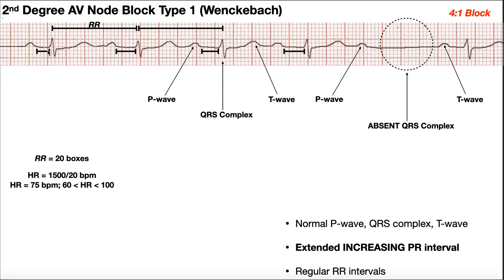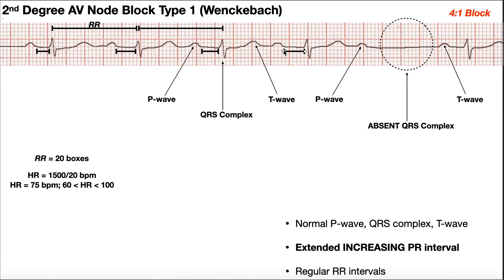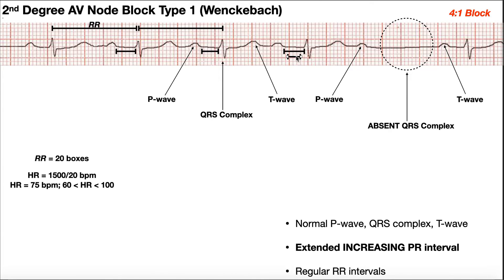Looking at this pattern, I like focusing on the horizontal line between the P wave and the QRS — it makes it easier to eyeball. This one is shorter than this one, shorter than this one, definitely shorter than this one. The PR interval is lengthening every time. As long as the last one before the QRS is dropped is longer than the first one, you can say it's an increasing PR interval and therefore type 1. The PR interval increases in size, then the QRS is dropped.